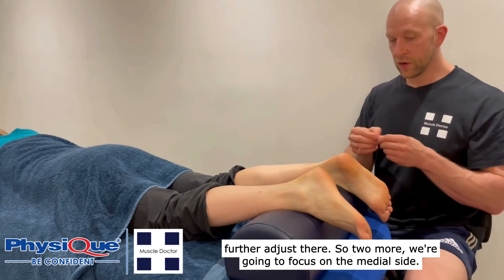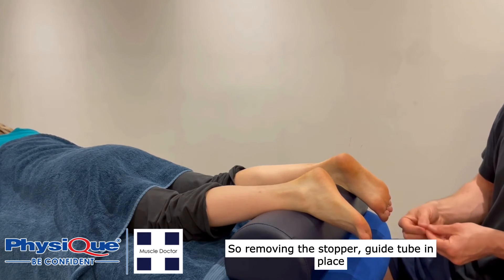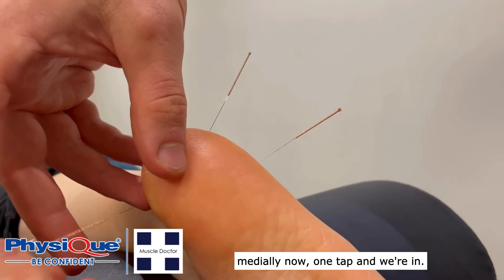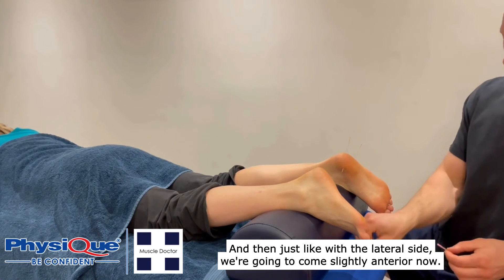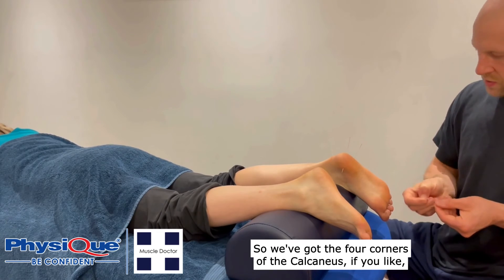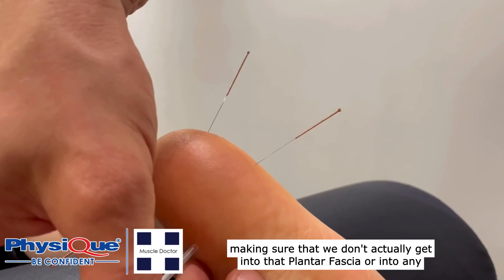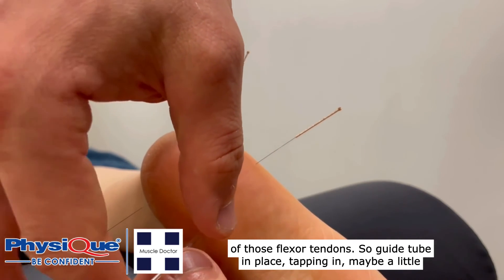Two more needles and we're going to focus on the medial side. Removing the stopper, guide tube in place medially now — one tap and we're in. Then just like with the lateral side we're going to come slightly anteriorly now, covering the four corners of the calcaneus if you like. Making sure we don't actually get into that plantar fascia or into any of those flexor tendons. Guide tube in place, tapping in.